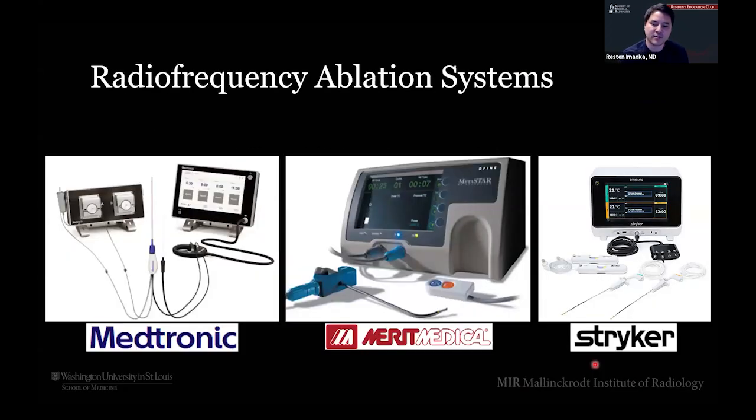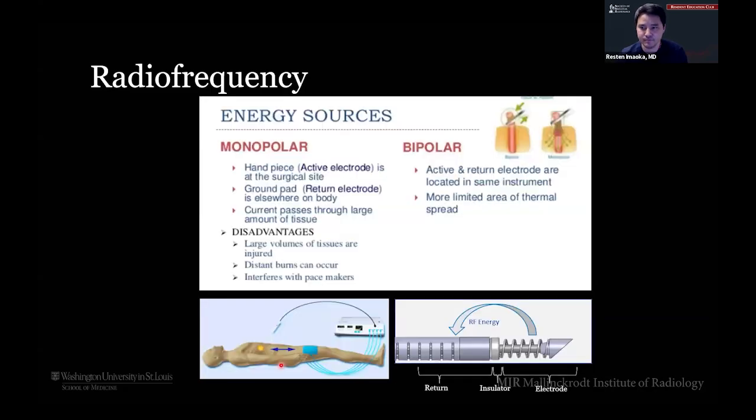Okay, so ablation systems, there's many out there in the world of interventional oncology. These are some of the big players, Medtronic, Merit, Stryker. They all are pretty similar, right? We're always doing bipedicular. We're coming in from both pedicles when we do these ablations to try to kill as much of that vertebral body as possible.